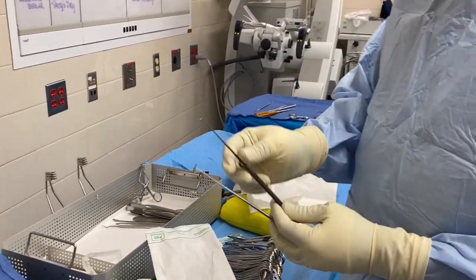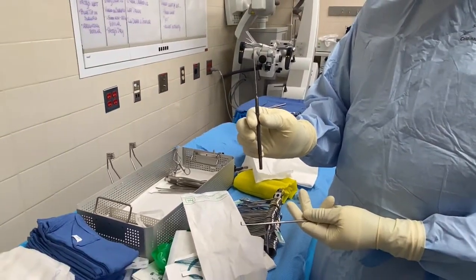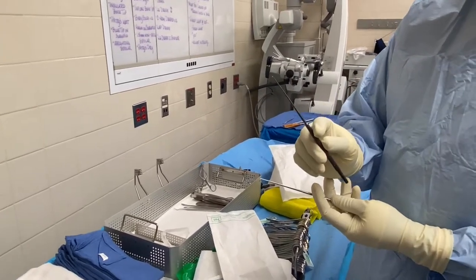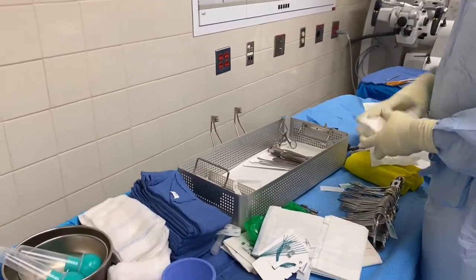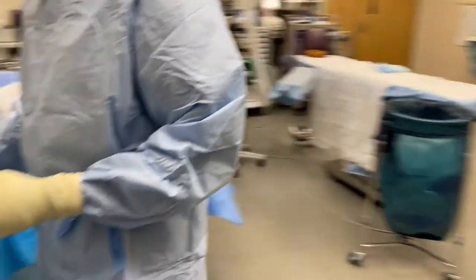For nerve hooks — this doctor usually uses this one nerve hook, and sometimes the micro nerve hook. This is a regular nerve hook; this is a long one and this is a shorter one.